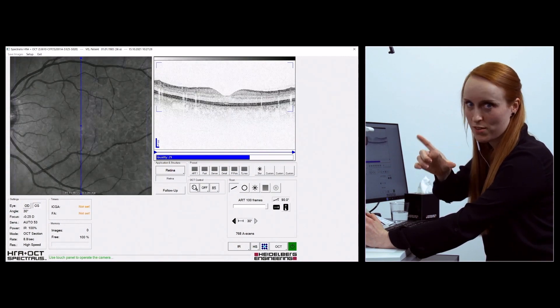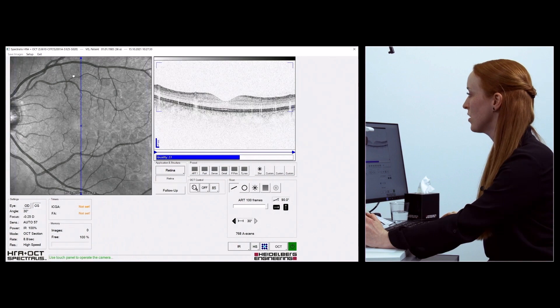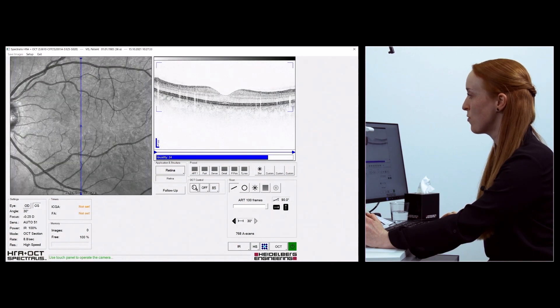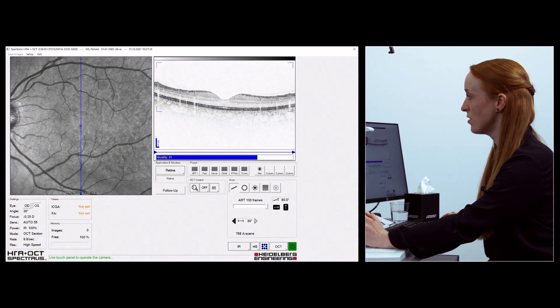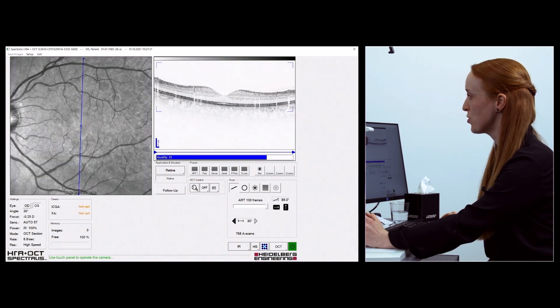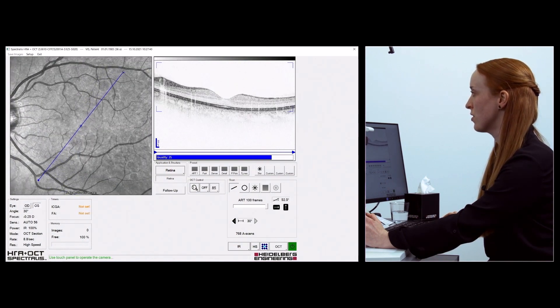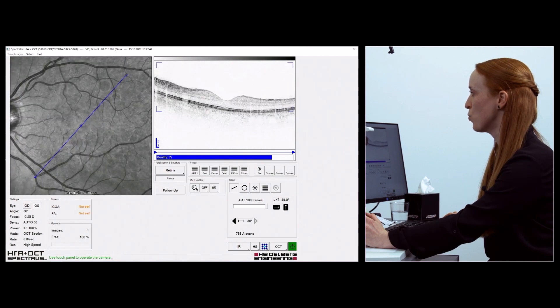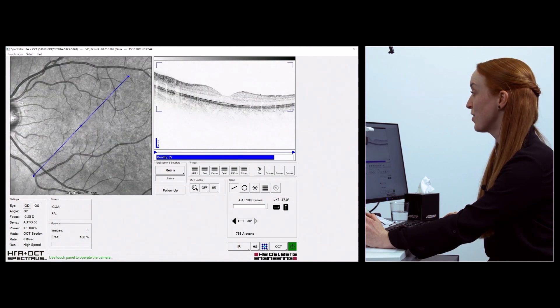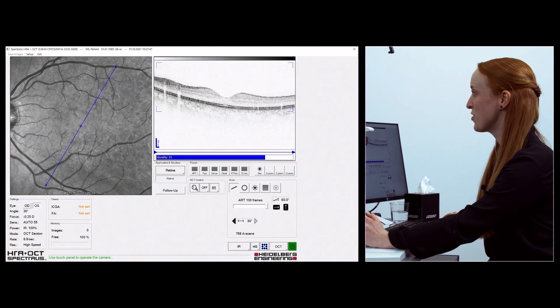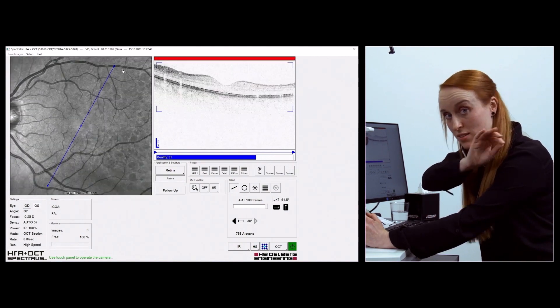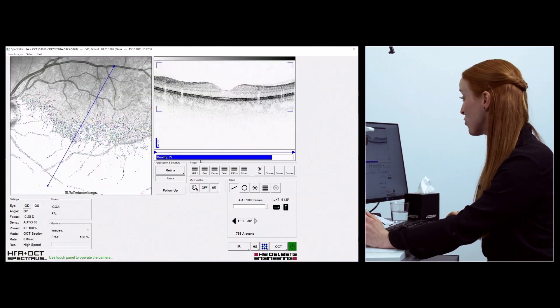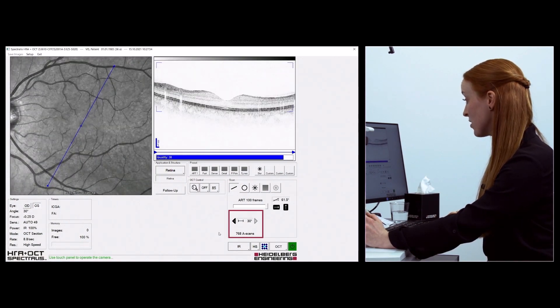But what you can do then is grab the arrow of your scan in your infrared reference image and just turn this scan to the direction while watching your OCT image, and hopefully it reaches one direction where it's really settled evenly.